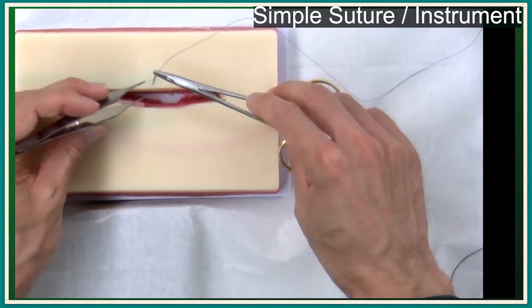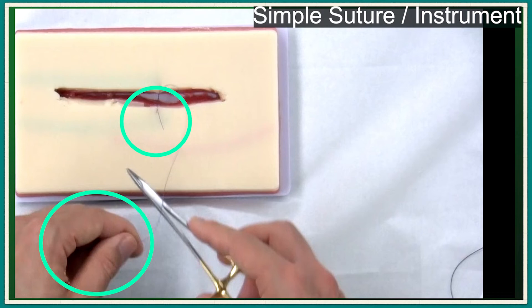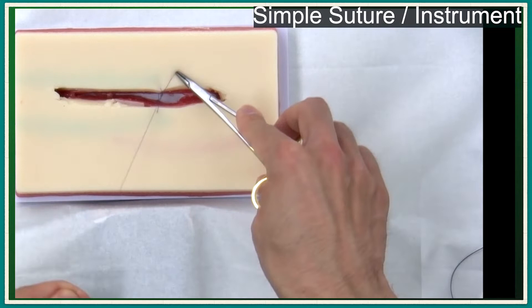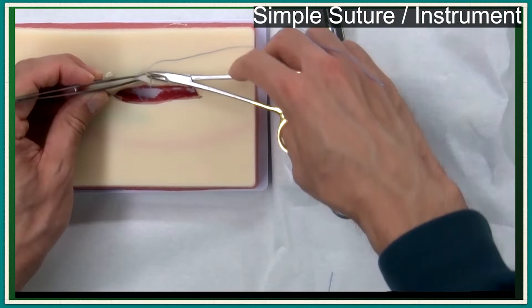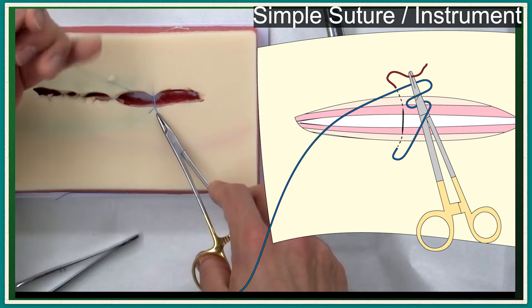The next part is instrument knot tying. In instrument knot tying, you should release both ends of the suture when you wrap around the needle holder. And the suture size is smaller, so a more secure locking technique will be needed. Basically, the first knot is a surgical knot. Wrap the needle holder twice and form a surgical knot.